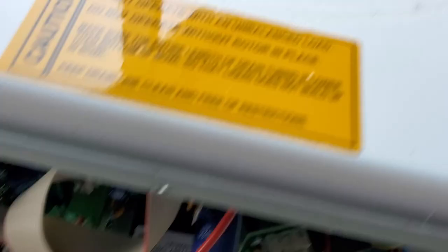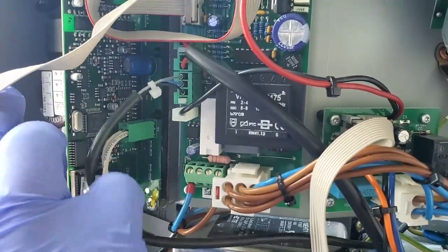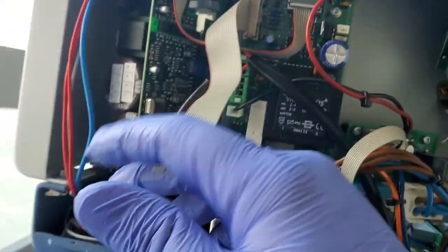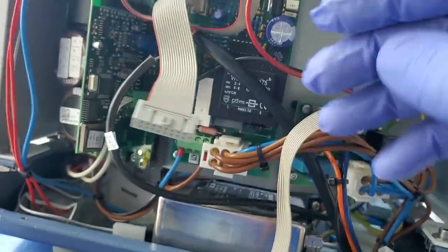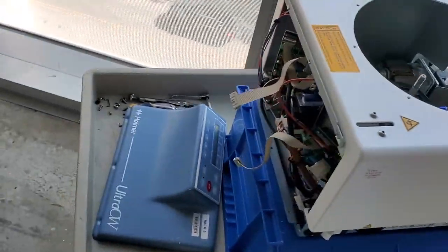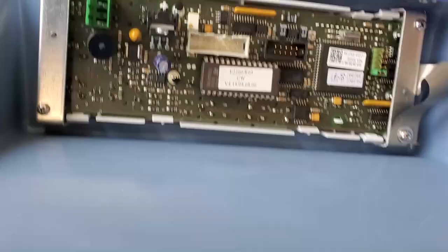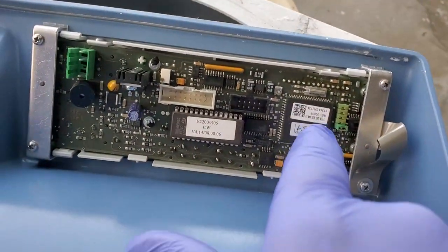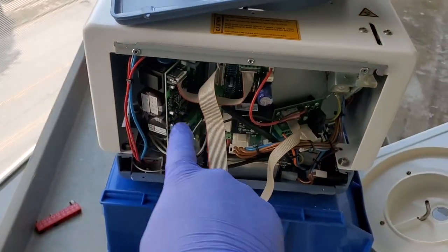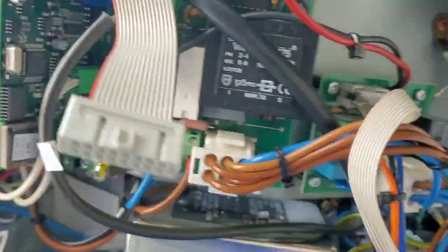This black wire goes up to the Hall effect sensor, which connects down here to the power supply — so the power supply is actually monitoring the Hall effect sensor. This other wire goes to the front panel control board, which has the CPU. As soon as it gets any logic signals indicating a fault, it shuts the machine down. The control board also monitors motor speed and makes adjustments to the variable frequency drive based on the registered speed from the Hall effect sensor.